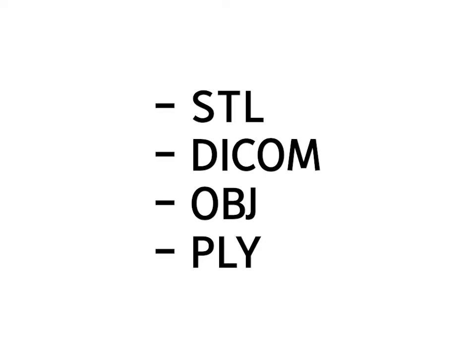The PLY file is another 3D image file used in dentistry. It is known as the polygon file format or the Stanford triangle format because it was developed at Stanford University. This file stores a graphical object described as a collection of polygons, and it contains the exact description of the object along with its color, texture, and transparency. Some intraoral digital scanners export the scanning data in this type of file.